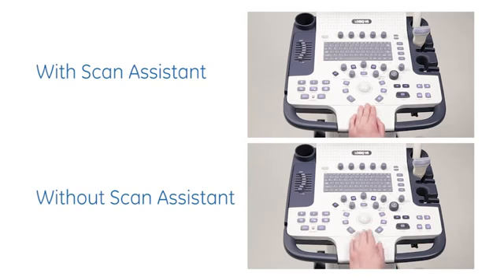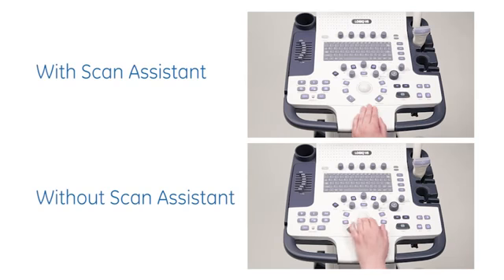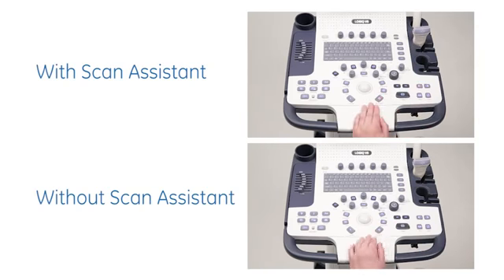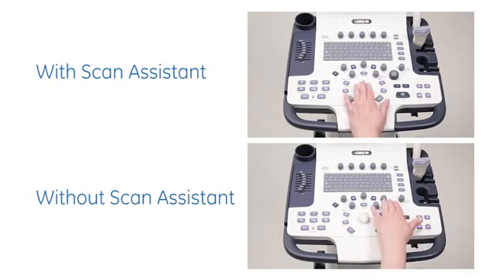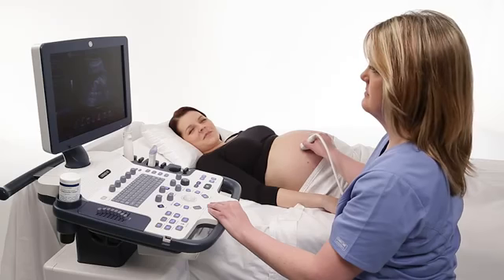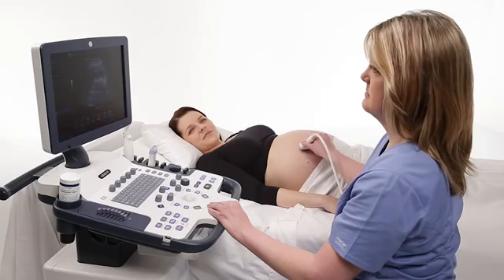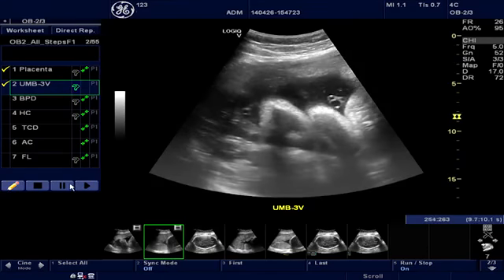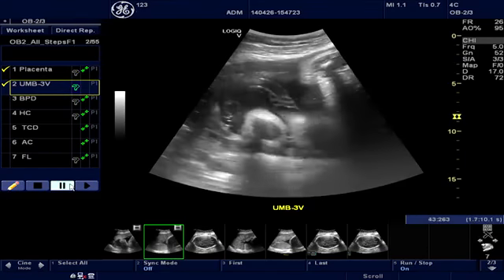The sonographer is performing the exact same exam — on the top of the screen she is using Scan Assistant, and on the bottom she is not. Scan Assistant enables one simple keystroke to combine functions; otherwise, the sonographer must interact with the system using keys spread all over the console. In case you want to capture additional views for a scan plane, you have the ability to pause Scan Assistant within an active protocol by pressing the pause key on the bottom of the left side of the Scan Assistant menu.